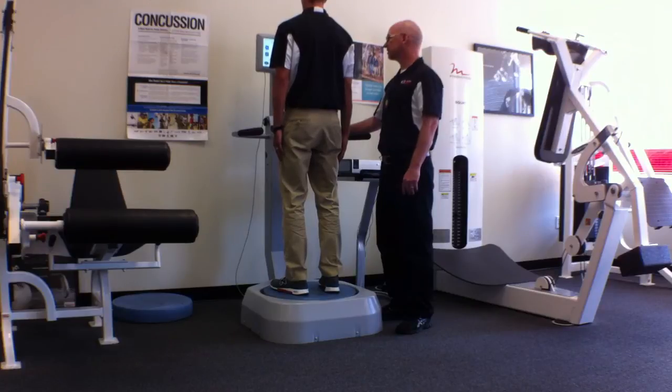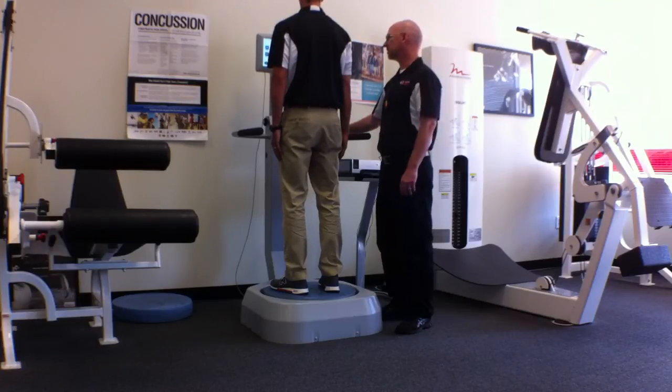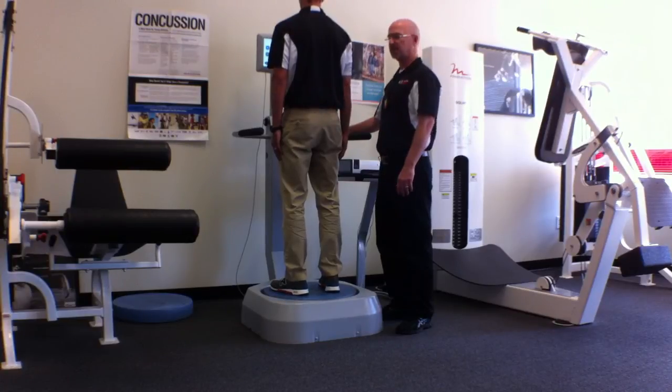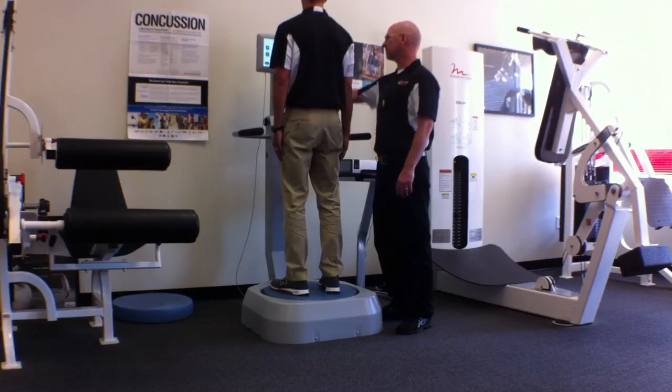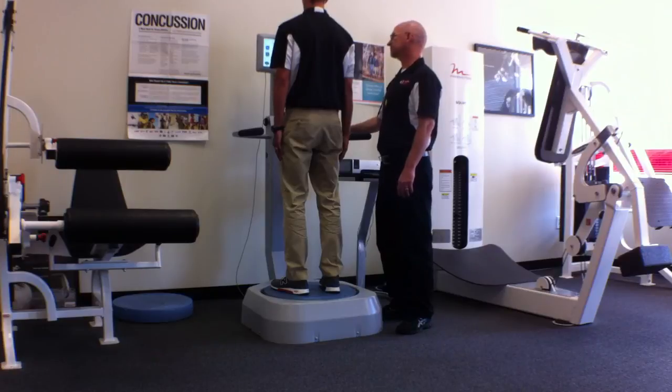Okay, he's done round 2, and then we're going to get a 10-second rest. When that gets down to 0, it's going to unlock again, so you have to be ready for that. You might want to be in range here. I think in our settings, we might go ahead and go with a gait belt on it if we're doing testing. You ready? Okay, here we go. Last round. Ten more seconds.